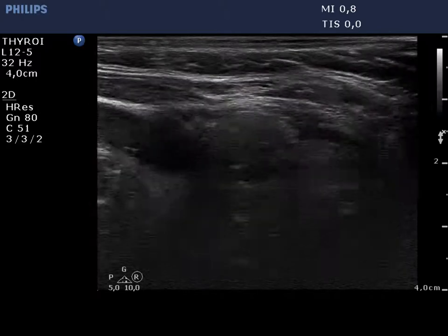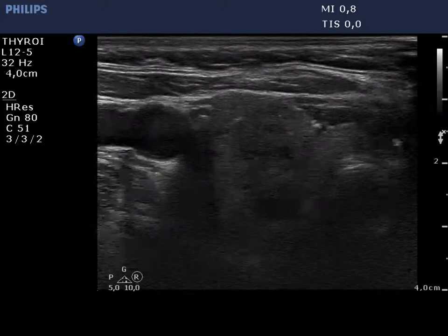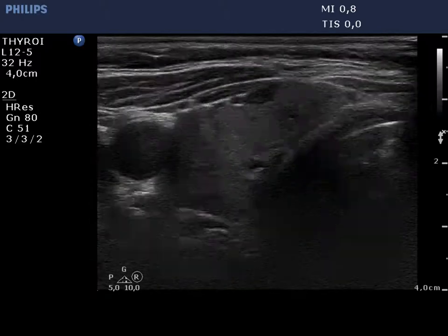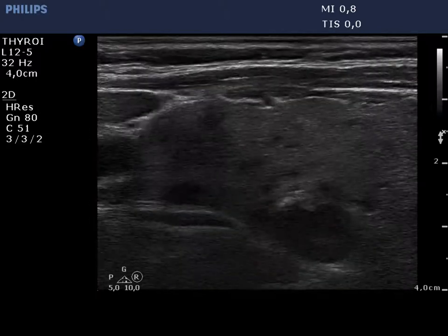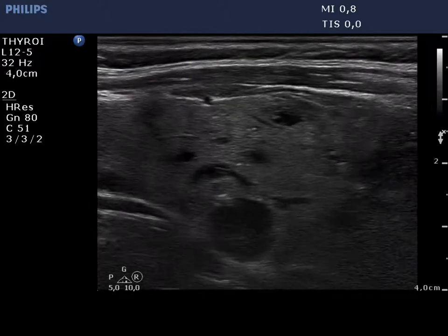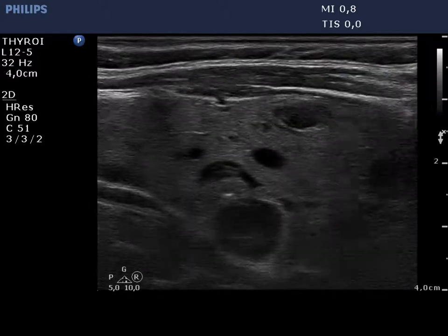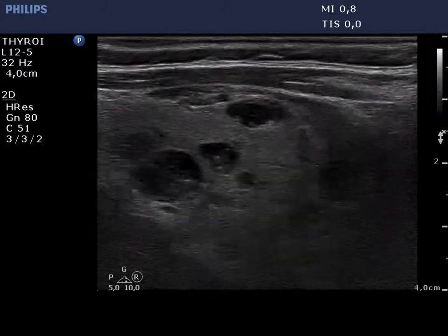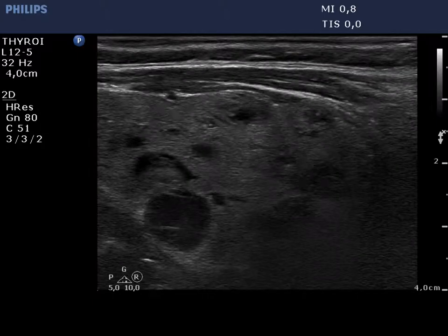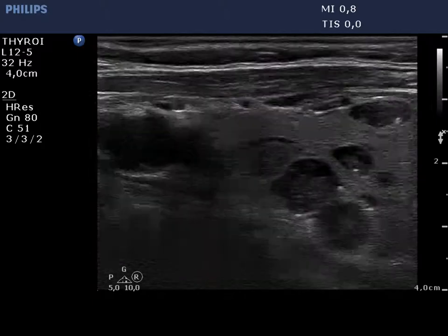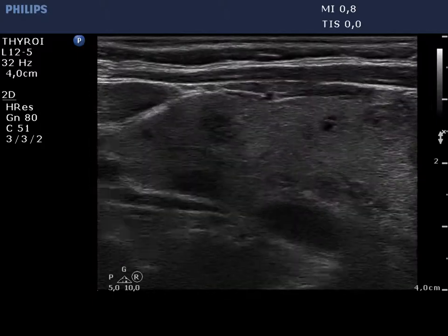The right lobe is echonormal and contains several hypoechogenic and moderately hypoechogenic lesions. Most of the nodules are cystic with hyperechogenic granules. The latter correspond to the so-called comet tail artifact.